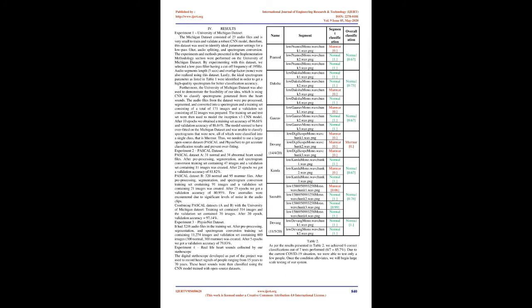Mobile application. To provide a portable system for analysis, we developed a mobile application using Android Studio and integration with Amazon Web Services, AWS, Amplify, AWS Storage S3, AWS Lambda, AWS GraphQL, AWS DynamoDB, AWS Cognito, and a Flask API. We used AWS Cloud Services because of its numerous cost-effective and scalable services. The application is compatible with devices having Android 6.0, Marshmallow, and above. Fig 11. Mobile application screenshots.